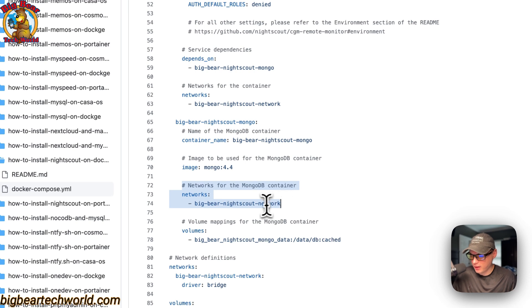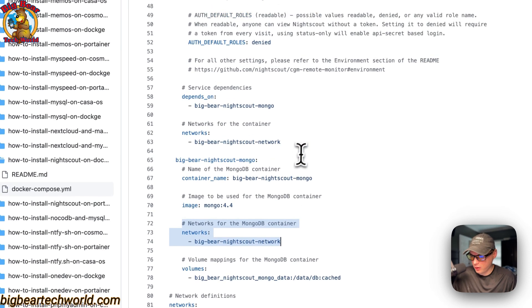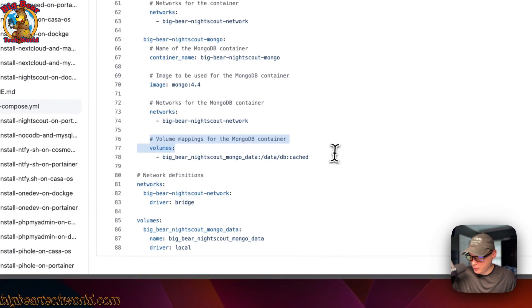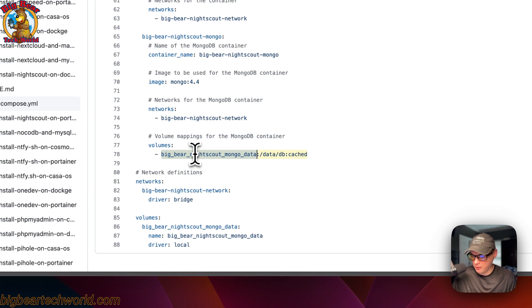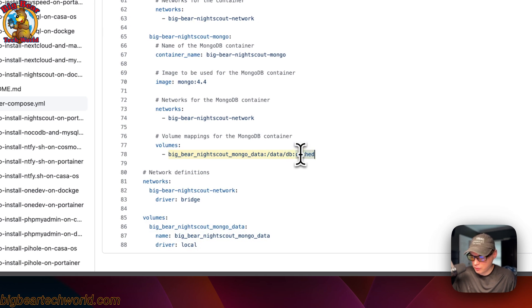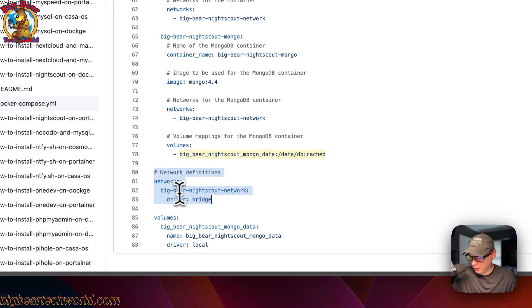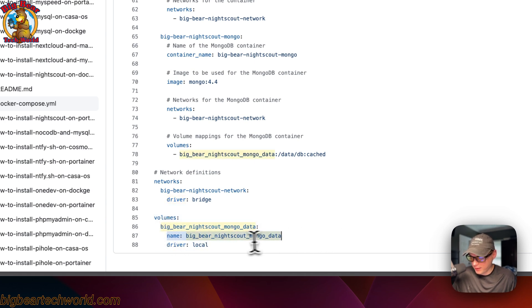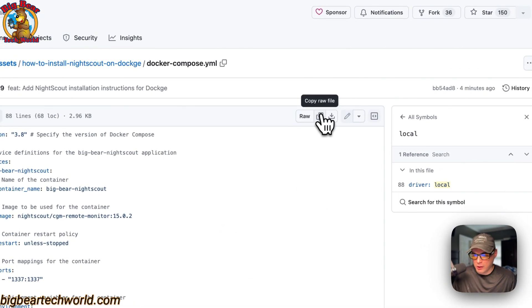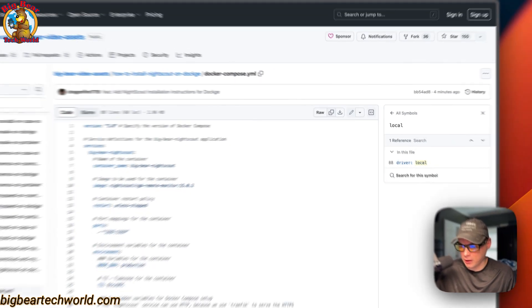The Mongo service is on the same network, 'big-bear-nightscout-network,' so we can use the service name to reference it. The volume is 'big-bear-nightscout-mongo-data,' a local volume defined at the bottom. On the container side it maps to '/data/db' and is set to cached. The network definition declares 'big-bear-nightscout-network' as a bridge network. The volume 'big-bear-nightscout-mongo-data' uses driver local, keeping the exact same name so Docker doesn't alter it. Now I'm going to copy the raw file and go over to Dockage to get the setup installed.